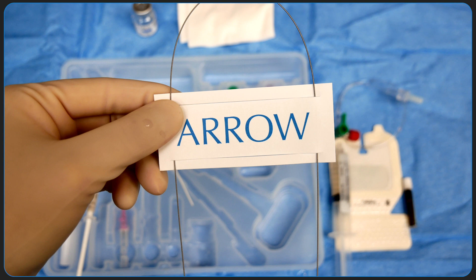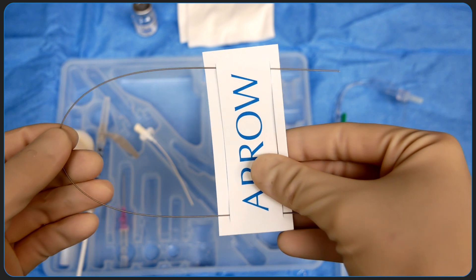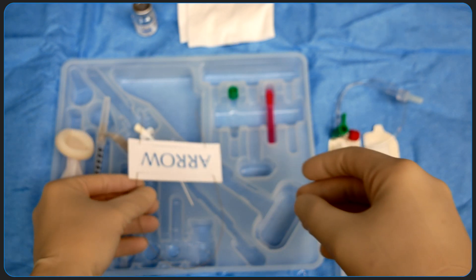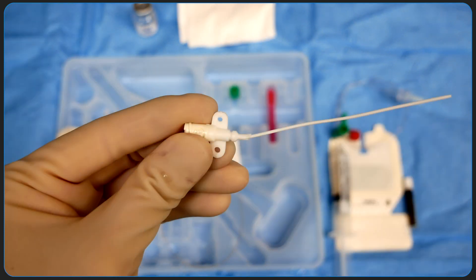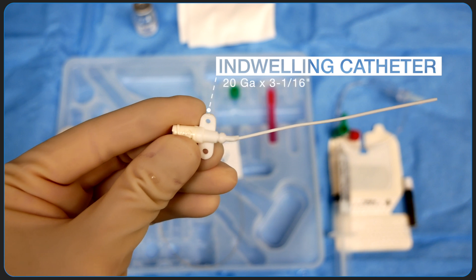This is the spring wire guide. It's 33 centimeters long and has a soft tip at both ends. Once the IV catheter is in the artery, we can use this wire to exchange for an alternative indwelling catheter, again using the Seldinger technique. The catheter in this kit is a 20 gauge catheter and it's about three inches long.